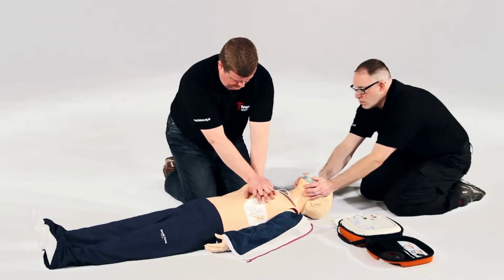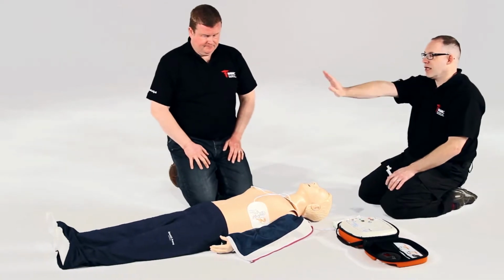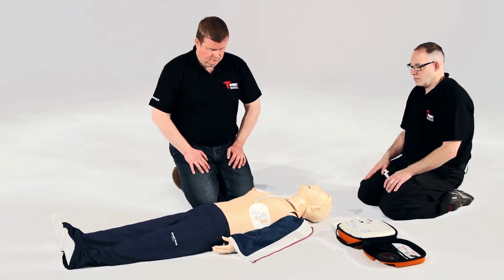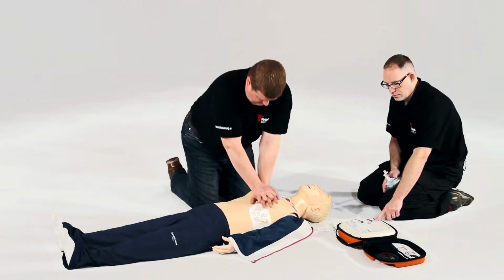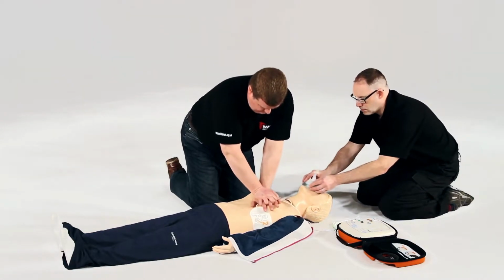Do not touch the patient. Analyzing heart rhythm. Stand clear. No shock advised. Begin CPR now. Carry on. Press the flashing blue i button for CPR voice prompt. First.